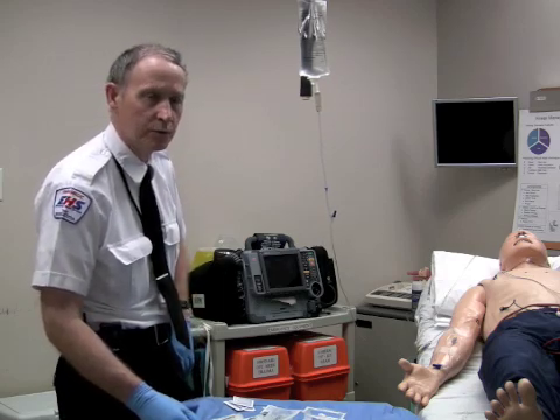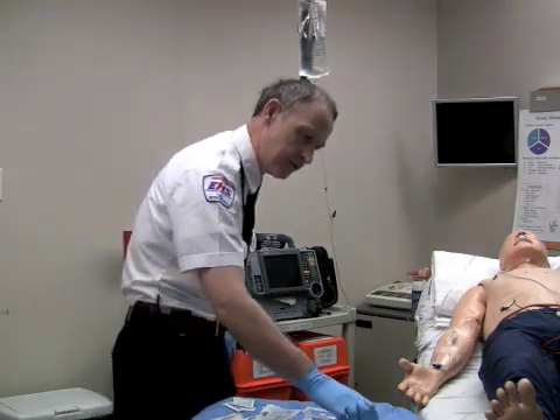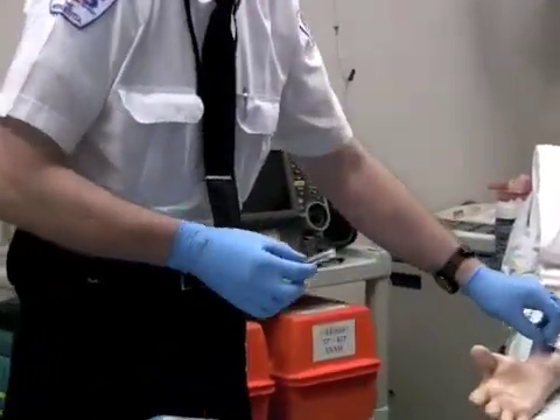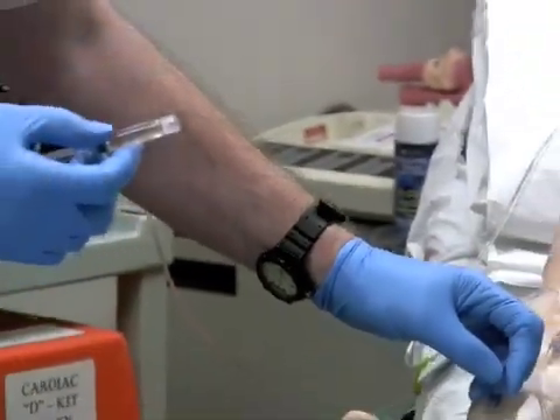As you know, there is an issue with the glass adenosine syringe in that it is futile to try to force the tip of this directly into our clave ports. It will ruin the clave port and the whole thing is for naught.